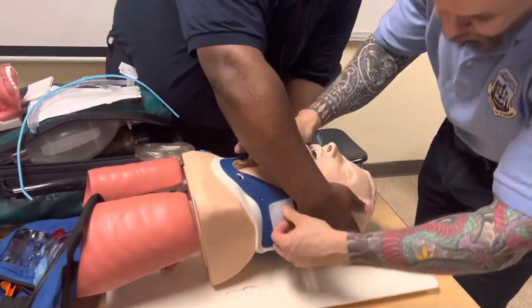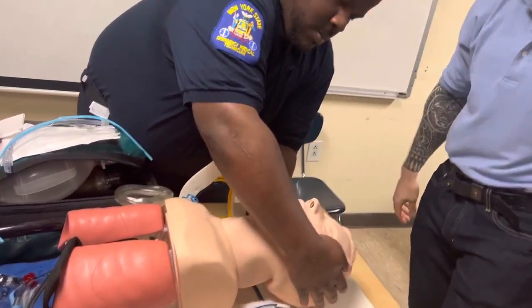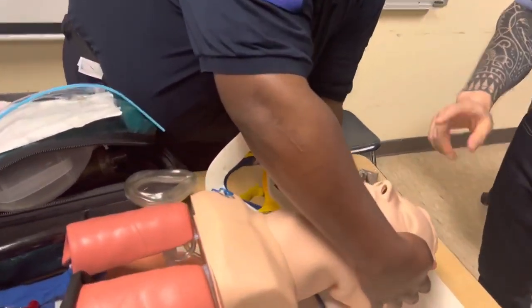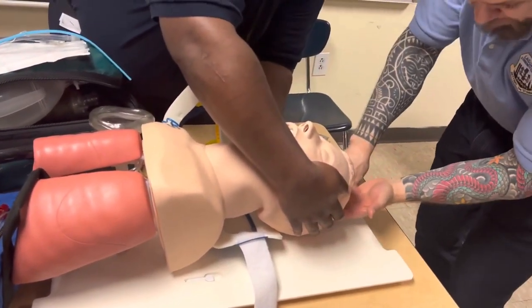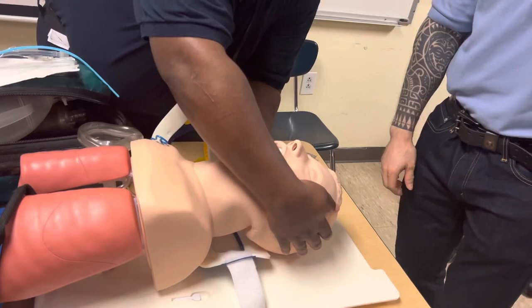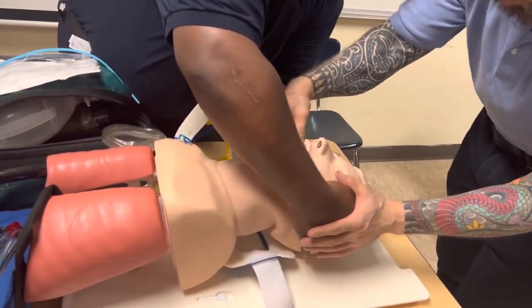Yeah, because I need the space. I'm going to open the collar, but I'm not going to take this off. I'm going to just leave it hanging like this, right? So now your job is basically holding the head so that I'm unable to lift the head with the laryngoscope up off the stretcher. Everybody see that? And just this forearm, I need this mandible to be mobile.